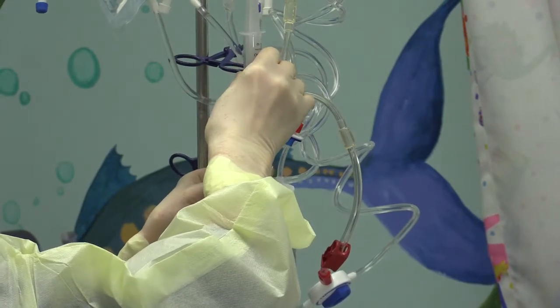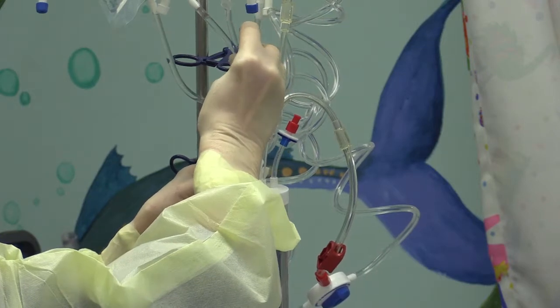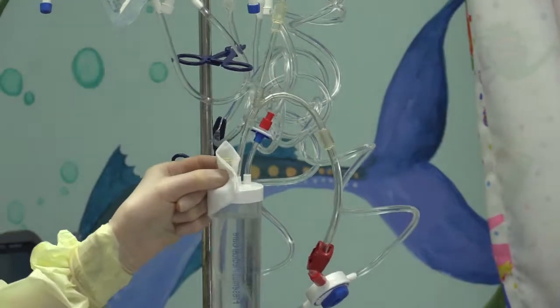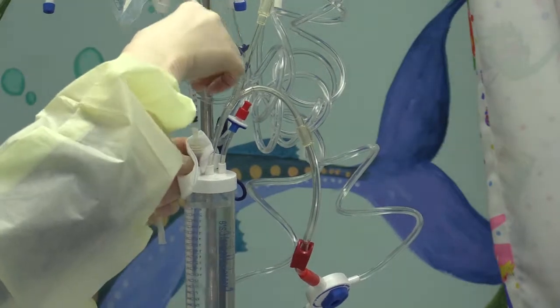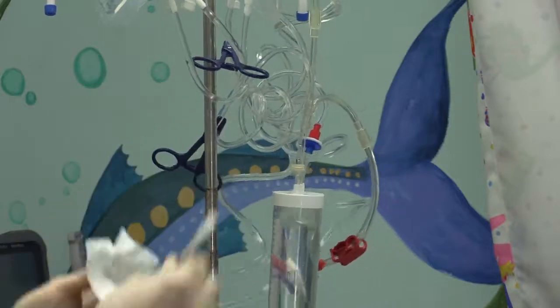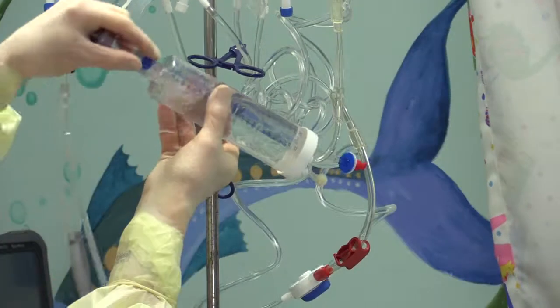Going to inject the cefazolin into the burette, followed by the gentamicin. And I'll just mix that.